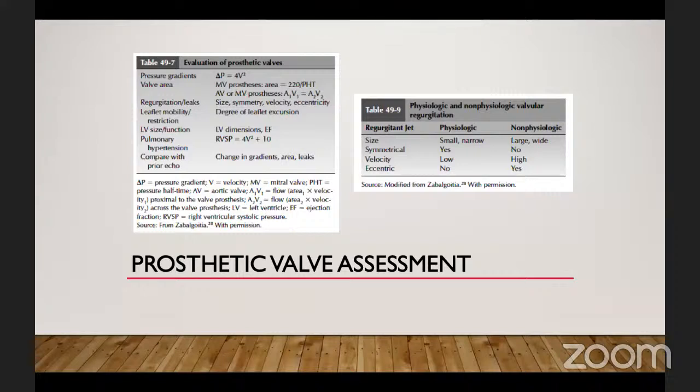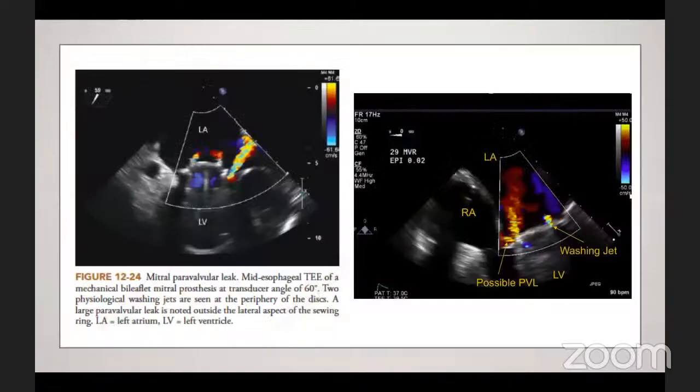One of the long-term complications, specifically with a mechanical prosthetic valve, is a stuck valve. A non-compliant patient presents with cardiogenic shock or pulmonary edema, having a mechanical stuck valve. Infective endocarditis, a lot of things that come with the prosthetic valve you can assess and evaluate by echo.